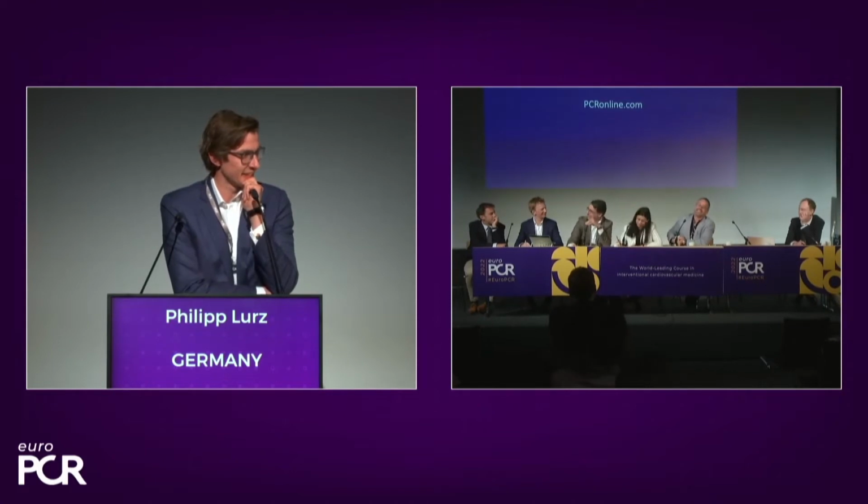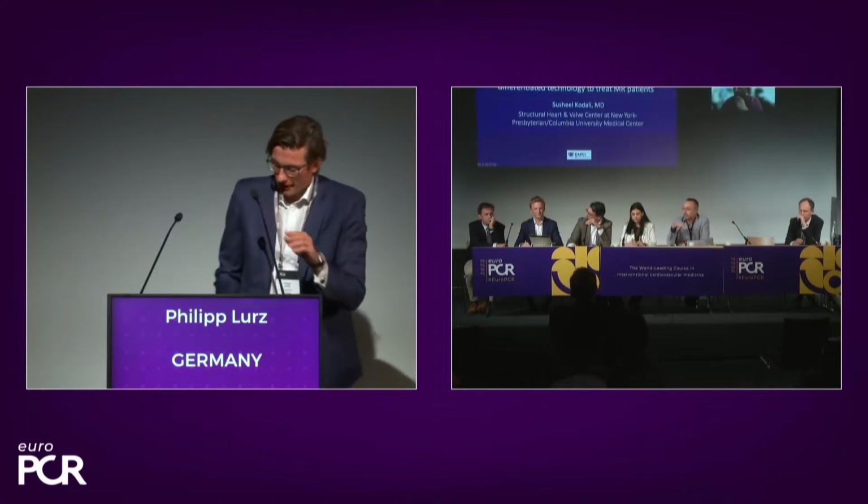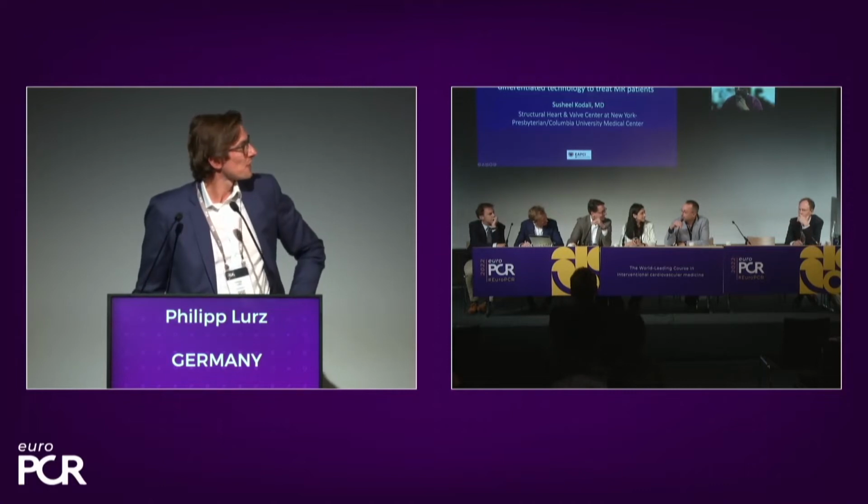Yeah, I think it's quite an unusual anatomy, and I didn't understand the etiology of the mitral regurgitation so far. Could you give us some more hints? Wolfgang, I thought the same. When I went to Leipzig, I thought, oh God, this is never going to be a good case.